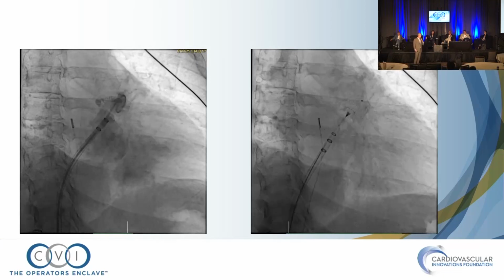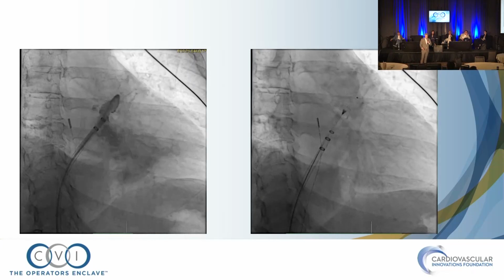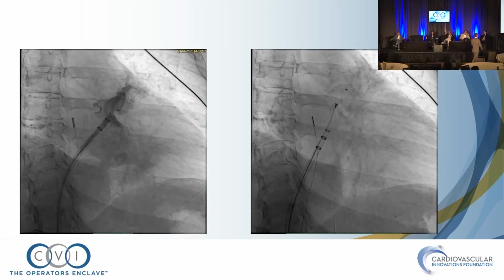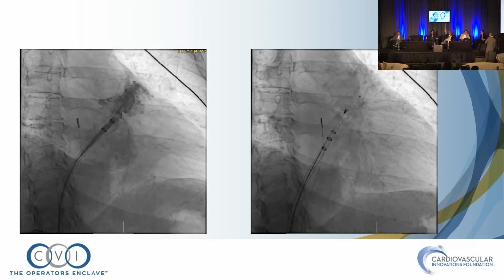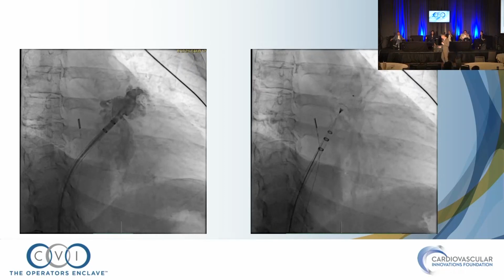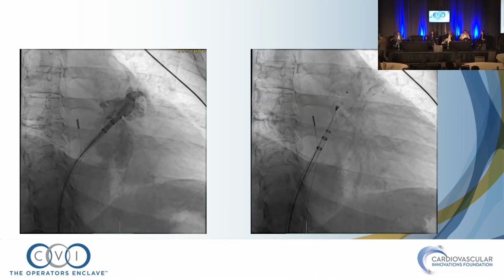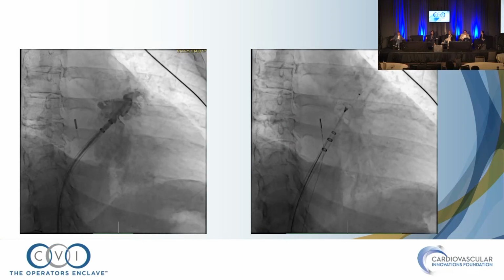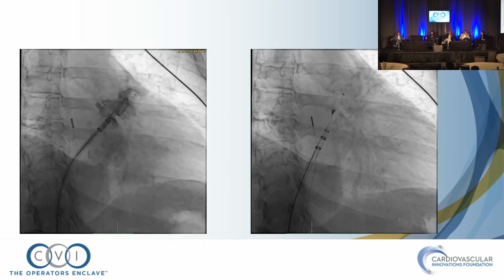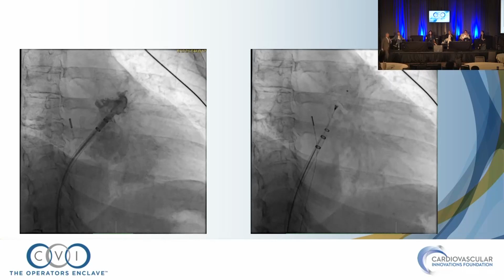We do our patients under conscious sedation, and we are meticulous about air management. Can you see these little bubbles here? Can you see those little bubbles? Do you guys see that? There are small air bubbles right there, which we initially didn't appreciate. We were thinking this is a great closure.